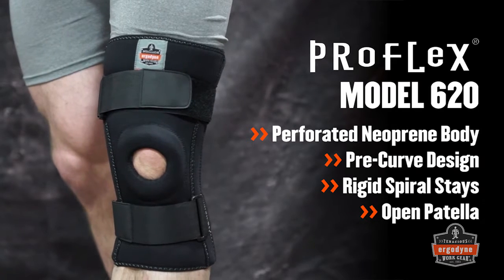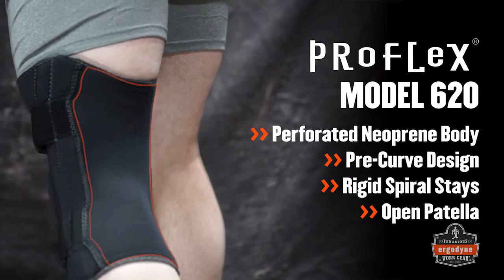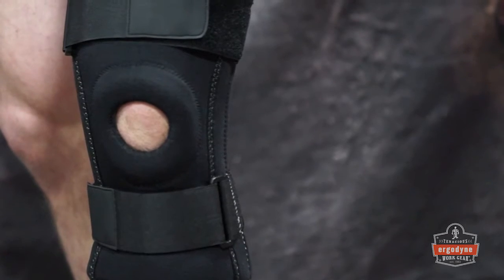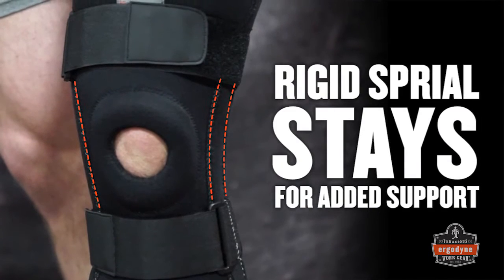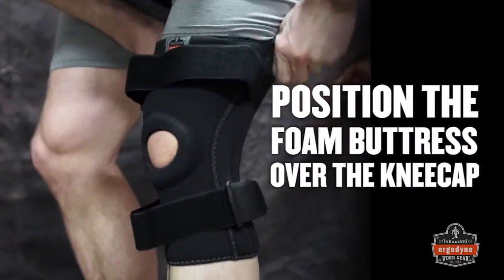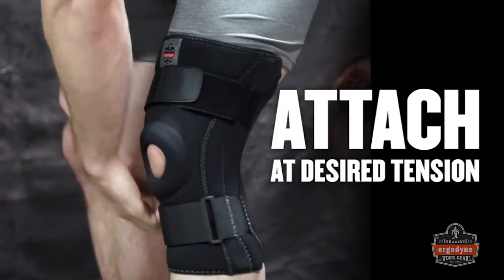The most supportive knee sleeve, the ProFlex 620 with open patella end stays, also features a perforated neoprene body but has a thinner panel behind the knee for added comfort and breathability. The 620 includes a cushioned buttress support around the patella for increased stability. Rigid spiral stays on each side of the knee provide additional support to crucial ligaments. Just pull up the support and position the foam buttress over the knee cap. Pull the hook and loop straps through the buckles and attach at desired tension.